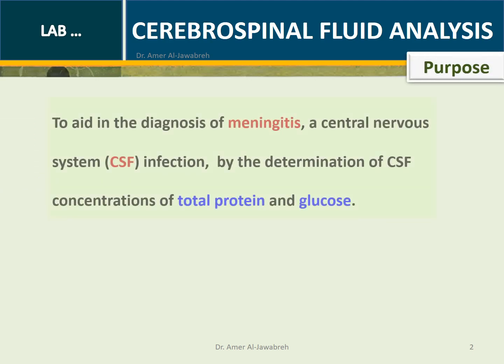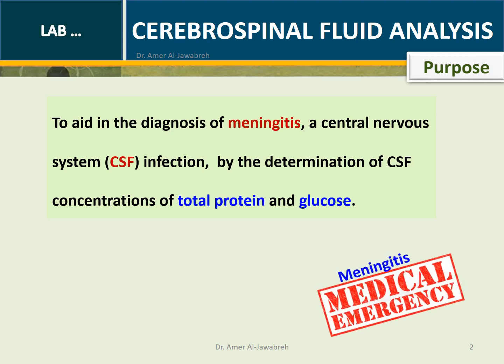Cerebrospinal fluid analysis. Purpose: to aid in the diagnosis of meningitis, a central nervous system infection, by the determination of CSF concentrations of total protein and glucose. Meningitis is a medical emergency.